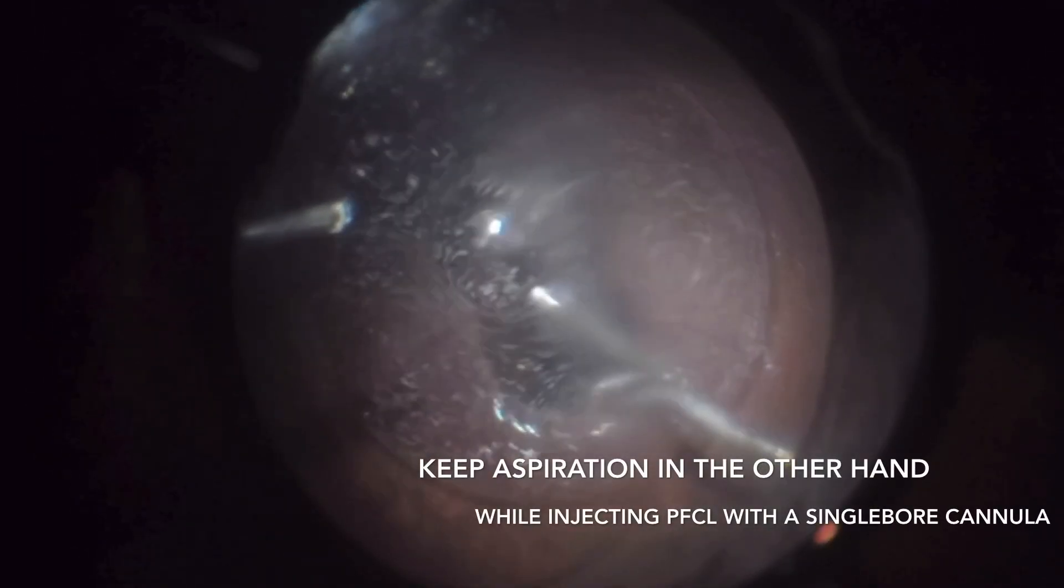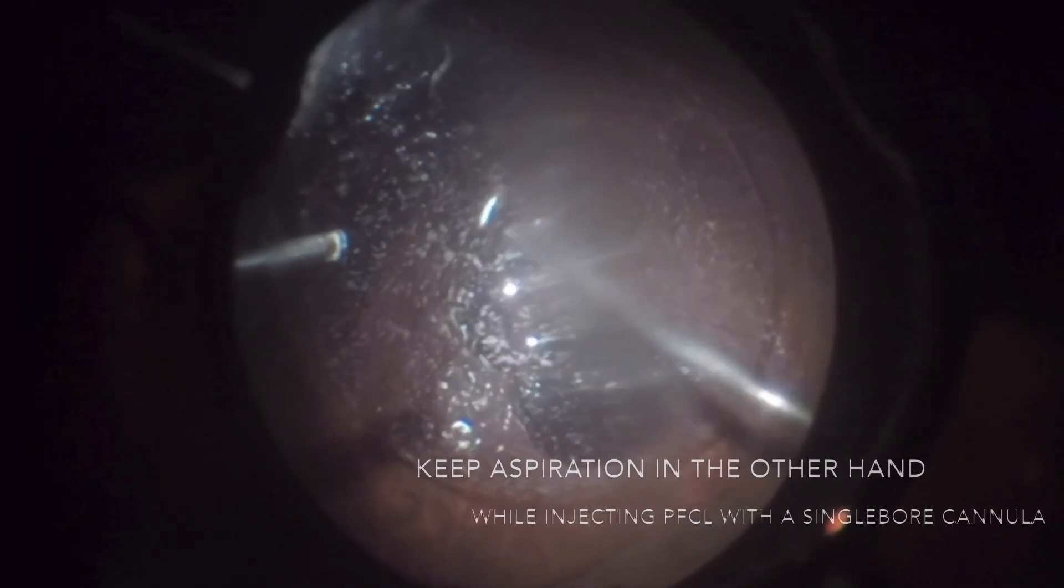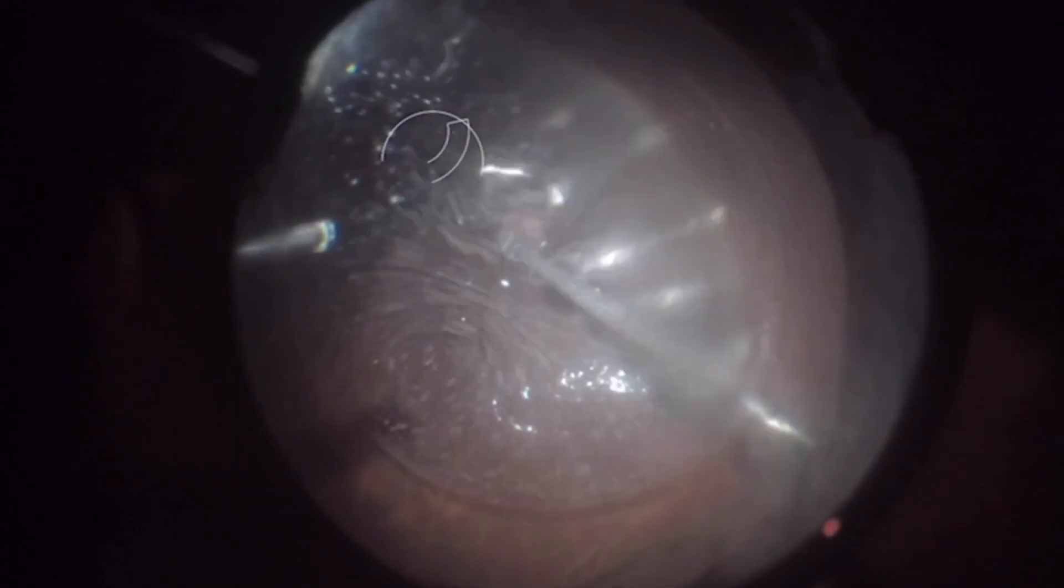An alternative technique involves injecting perfluor with the dominant hand while simultaneously aspirating fluid with the vitrector held in the non-dominant hand. This method helps balance the IOP and effectively control the injection flow.